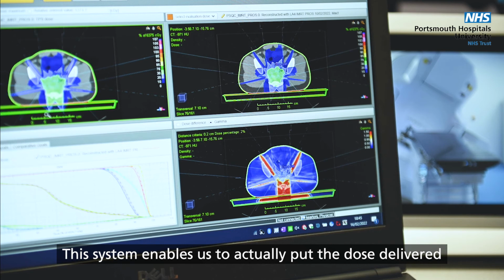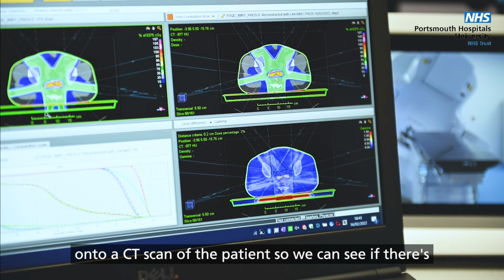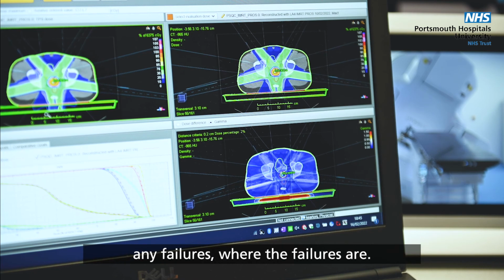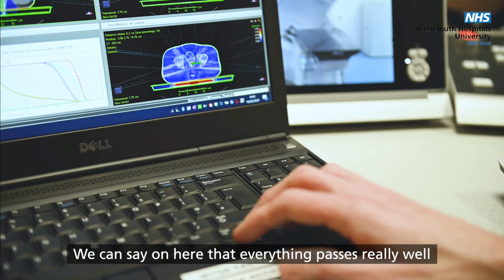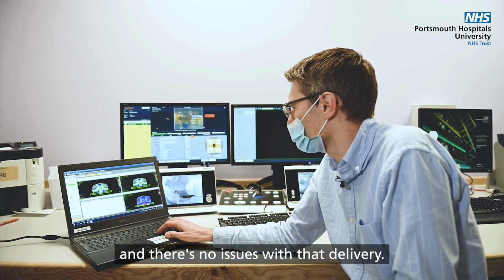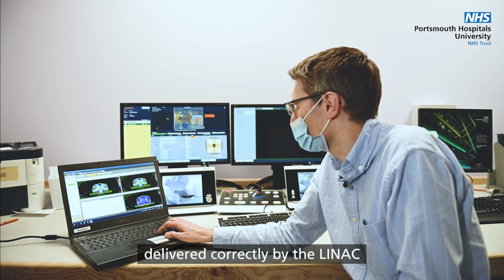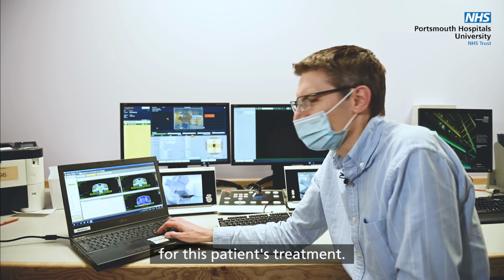This system enables us to actually put the dose delivered onto a CT scan of the patient so we can see if there are any failures, where the failures are. But you can see on here that everything passes really well and there's no issues with that delivery. So we're quite happy that the dose of radiation has been delivered correctly by the LINAC for this patient treatment.